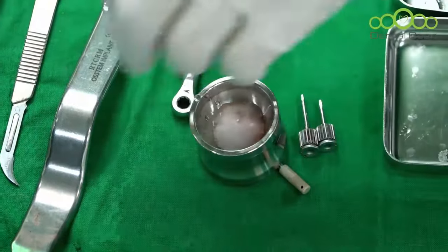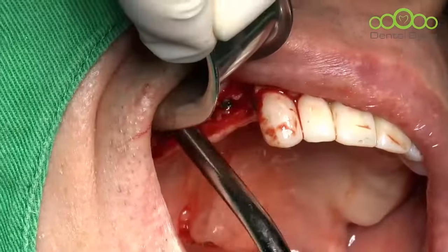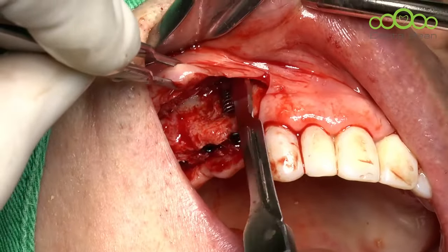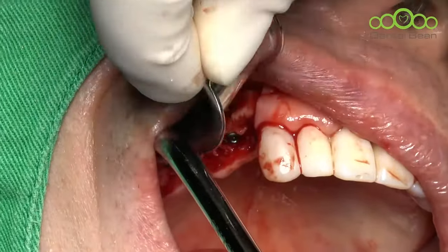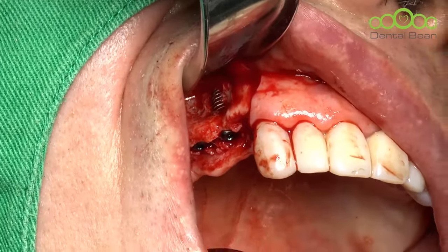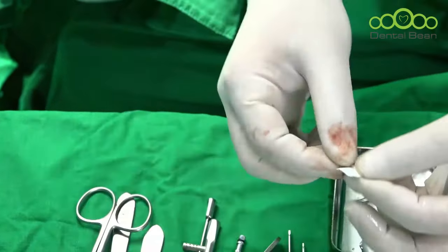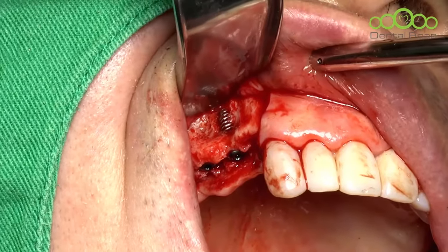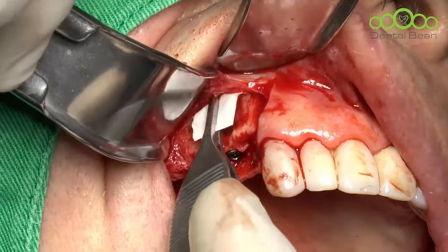Okay, let's release first. Membrane. Hold on. Hold it. I'll release slightly. No need for too much releasing. Relax, relax. I release the buccal flap slightly. Very slightly, I release the flap. Okay, it looks enough. Then, the membrane looks a bit big. No need for such a big membrane. I'll cut. Let's apply the membrane at the buccal side. No need to cover the palatal side, so I will just position the membrane on the buccal side, like this.